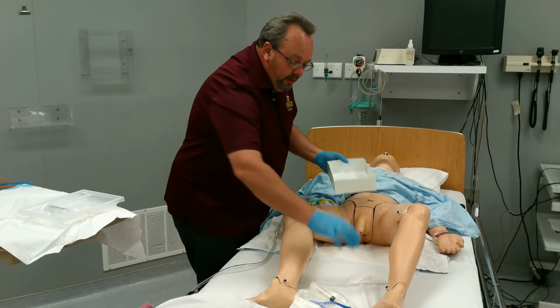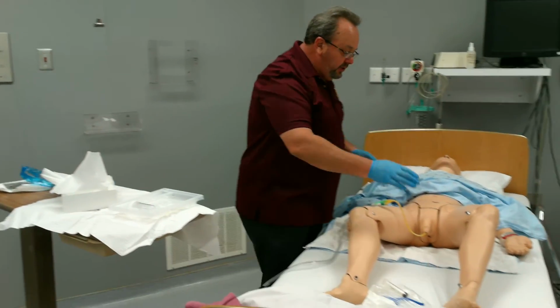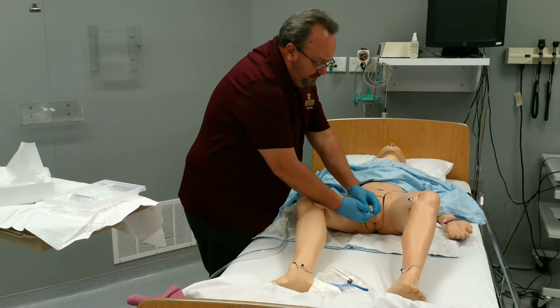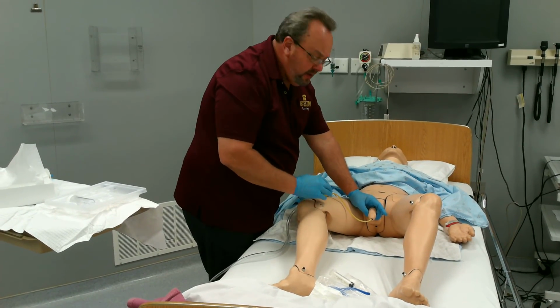Then clean up. And it is good to wash off any excess betadine here, because betadine can irritate the skin.